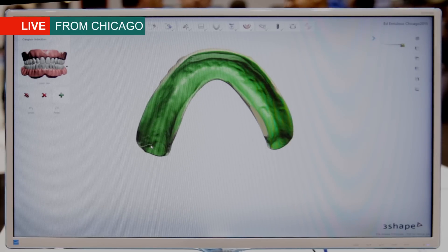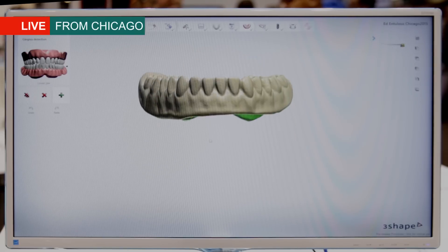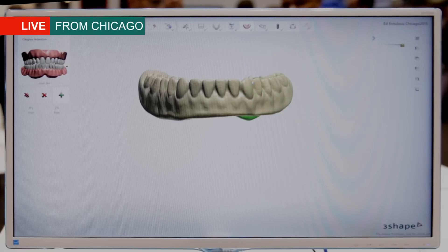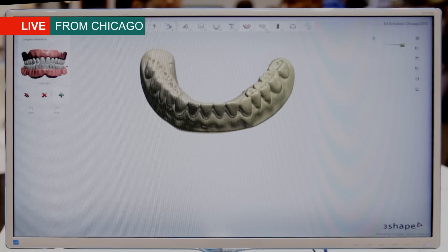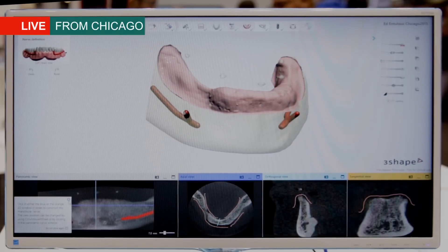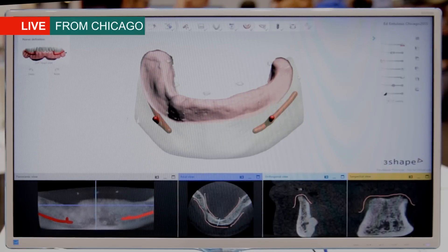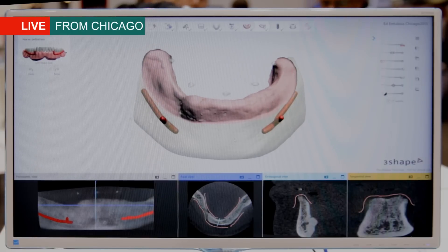The next step is a gingiva marking step, where we mark the inner surface of the denture to extract the gingival information that we'll later use in the guide design and calculation of the surgical guide. We also have diagnostic tools such as nerve marking, and here we can see how the gingiva has been spanned across the jaw based on the marking that we just did.